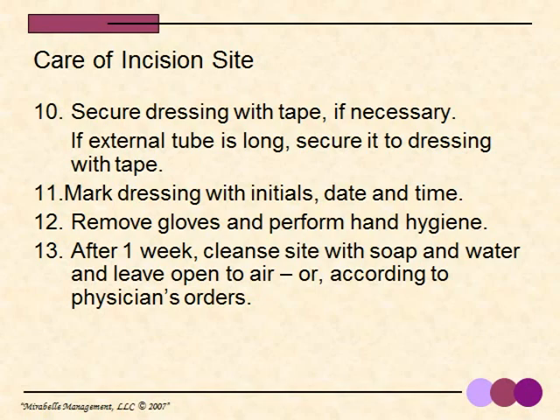You can mark the dressing with your initials, the date and the time of the care. Now you can remove your gloves and perform hand hygiene. After a week, you want to cleanse the site with soap, water, and leave it open to the air, or according to the physician's orders.